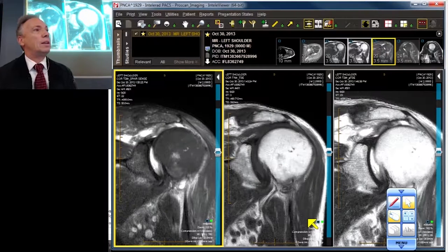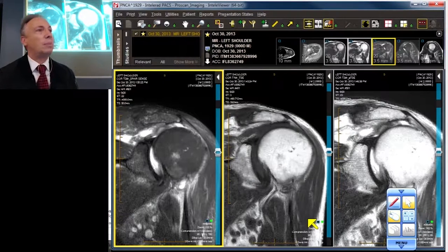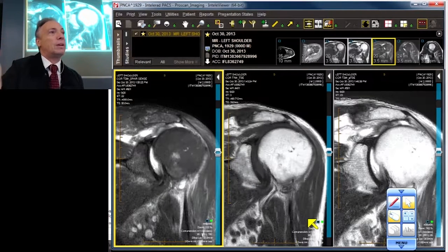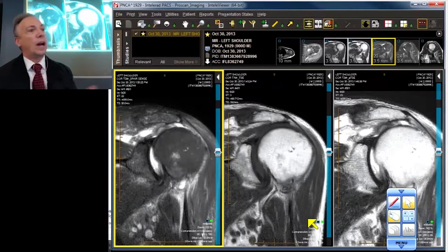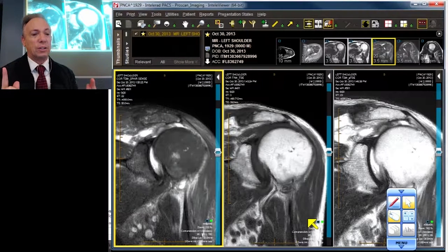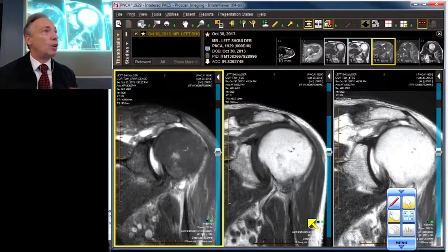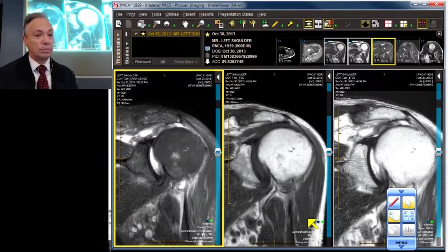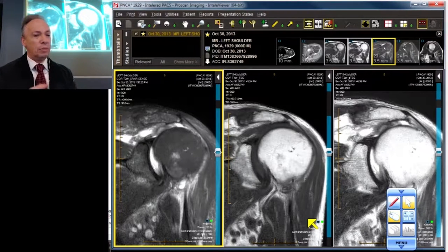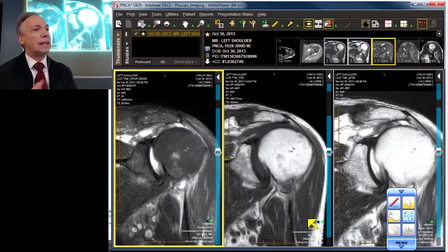We're talking about the six key components of the rotator cuff complex: the supraspinatus, the infraspinatus, the teres minor, the subscapularis, the capsule, and the coracohumeral ligament. We've shown injuries of all of them and how to assess them in different projections, but I want to focus for a moment on the surrounding anatomy.